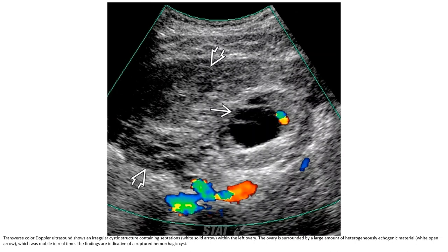Ultrasound of an adnexal cystic structure containing internal debris. The ovary is surrounded by a large amount of heterogeneous echogenic material, which was mobile in real time. The findings are indicative of a ruptured hemorrhagic cyst.